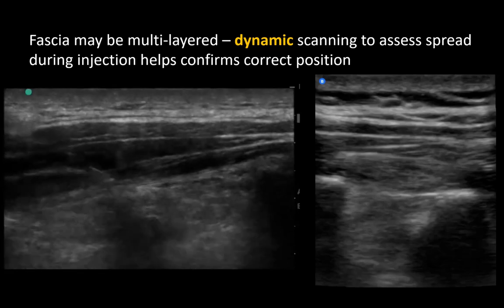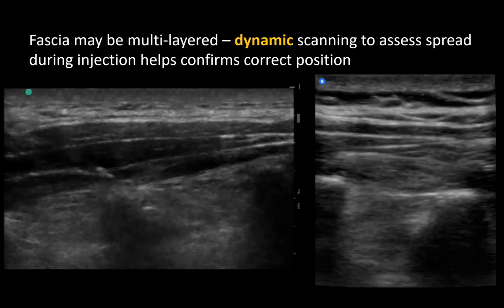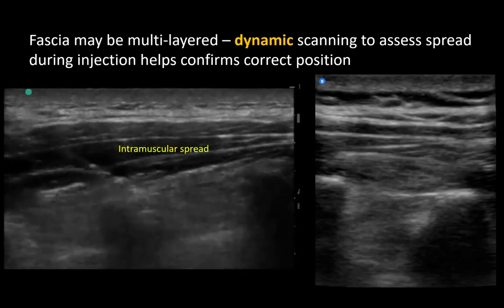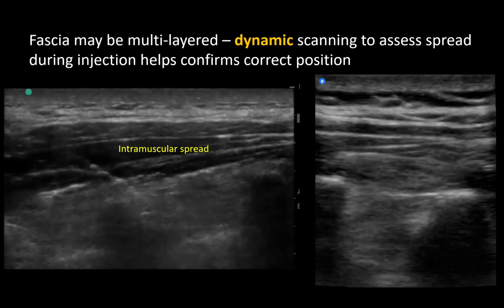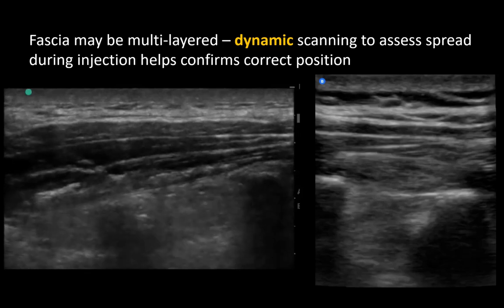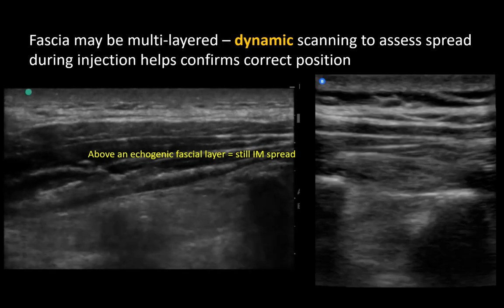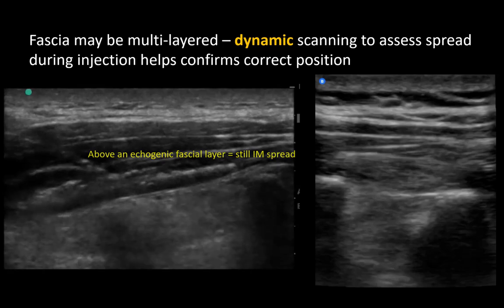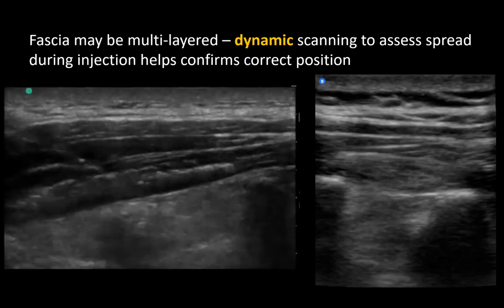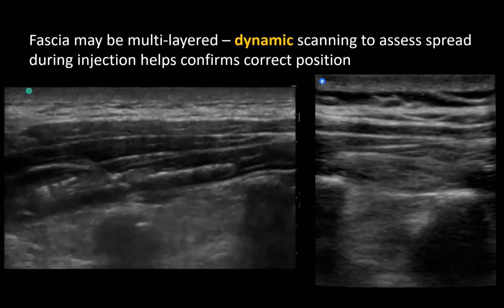It can sometimes be tricky to identify the optimal plane of injection, as these two videos will show. There can be several layers of fascia that form the deep layer below the erector spinae muscle. It's important that you perform dynamic scanning during the test injections and use the non-active fluid to avoid wastage of local anesthetic. During the dynamic scanning, look for the deepest bright white fascial layer overlying the transverse processes and the darker intertransverse tissues. Where necessary, insert the needle deeper to ensure that the needle tip and fluid spread lie below that deepest white fascial layer.